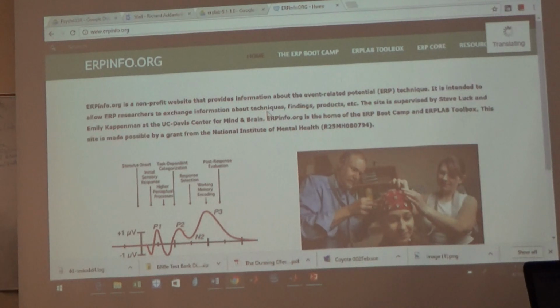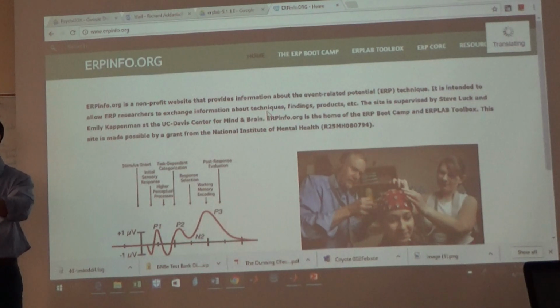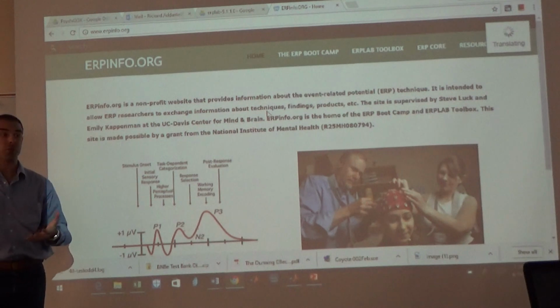We're just going to download ERPLab. Okay, that'll take just a second. Sometimes it acts a little funky, and sometimes I've noticed in other classes when I've taught this, when I give a folder to people, it'll work at first, but then it'll give an error message like this, and it works just fine if you download it yourself from the original site. I don't know why that is the case. I've just noticed that this is one solution that we can use as a workaround.